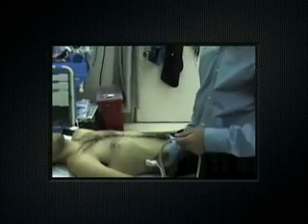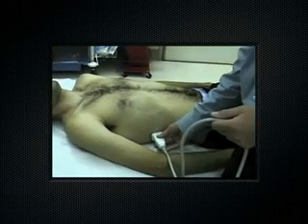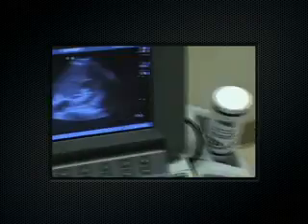Now, if we talk about the renal scan, you pretty much did one during the FAST exam, but you come over here and you get a nice coronal view of the kidney. You can actually get the kidney's upper pole and lower pole on the screen at the same time in a long axis. If you rotate the probe 90 degrees, you can get a short axis of the kidney. Rotate the probe towards the ceiling, and you get a short axis of the kidney fanning through.